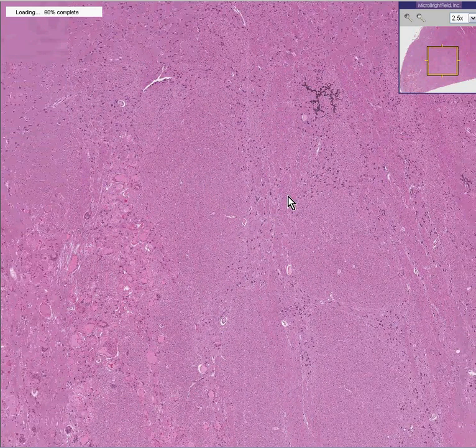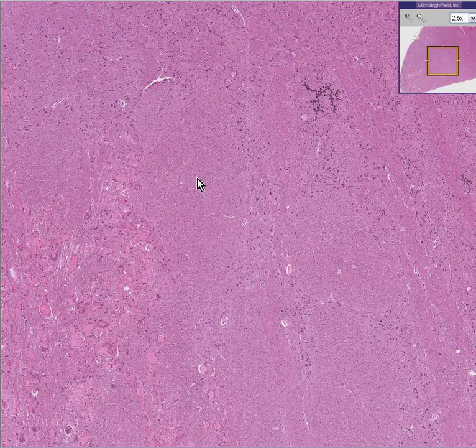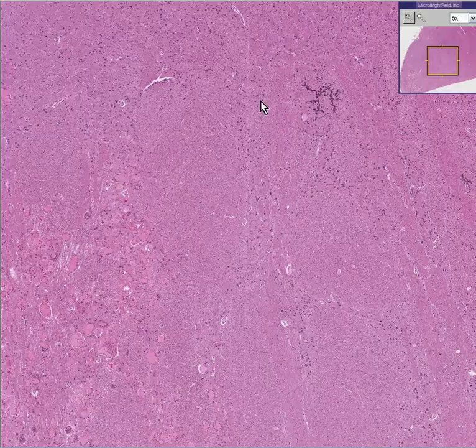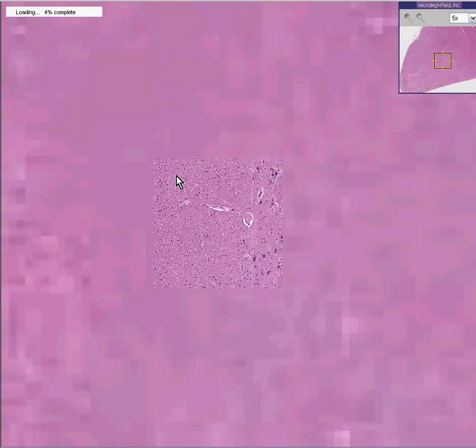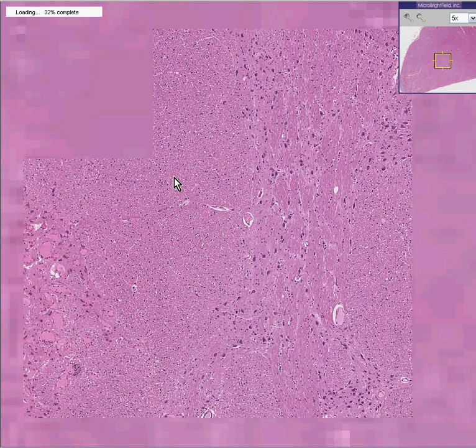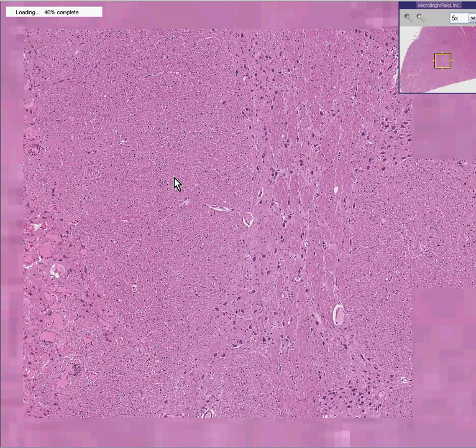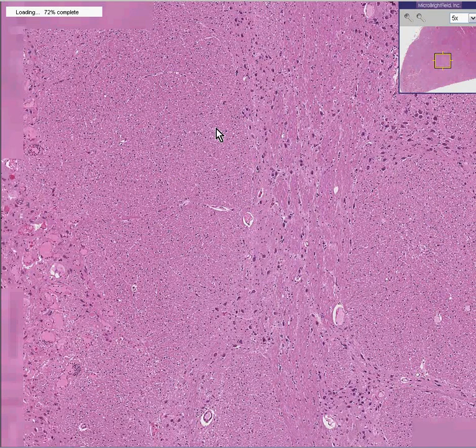You could see the areas here and here where these large neurons are perhaps more gray matter or nuclear type areas, whereas areas here in which you have a failure to see larger neurons that are mostly glial cells and myelinated tracts is white matter. This is a really good example. This happens to be the pons, but it could be anywhere. You could instantly see these larger cells as being neurons, and you can see lack of them in the tracts.